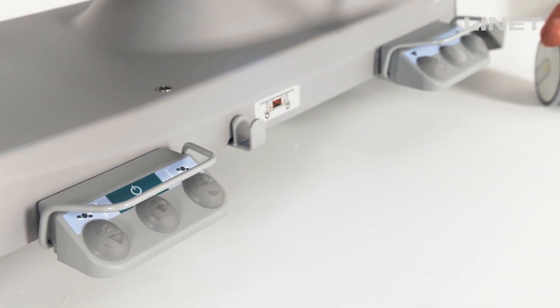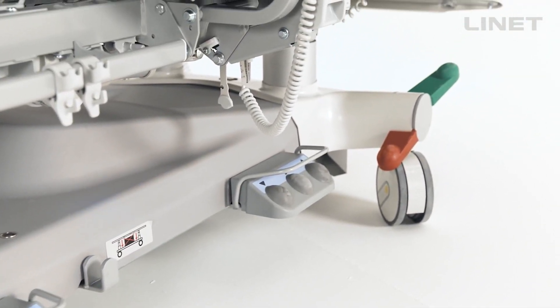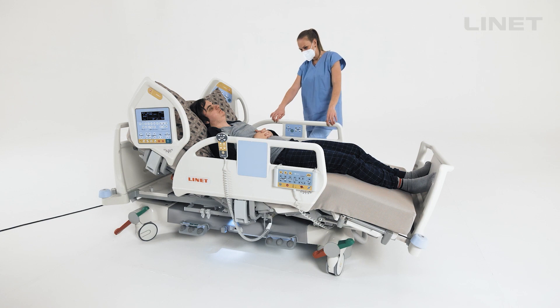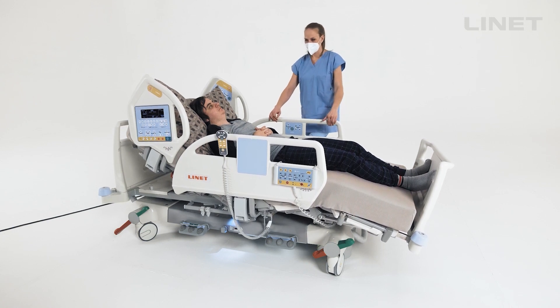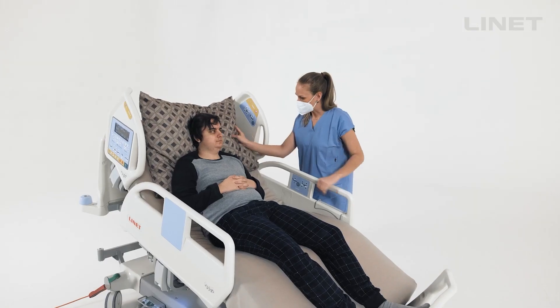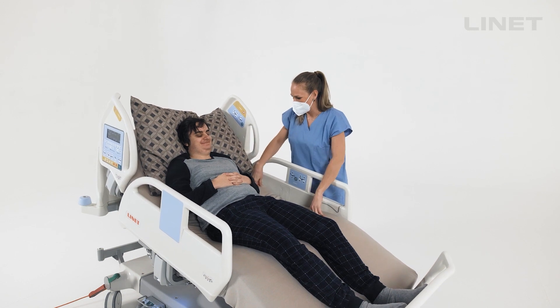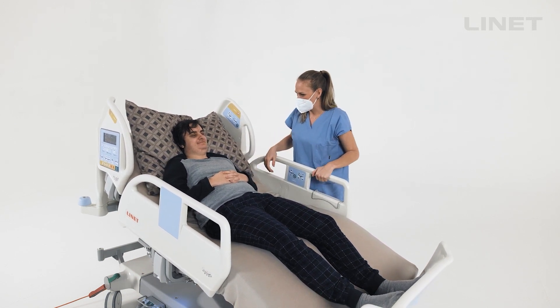Foot pedal controls are practical tools to operate the bed without hands. The nurse can have immediate contact with the patient and can see and react if anything happens. When the procedure is done in a sterile environment, there is no need to change gloves, because the bed position can be adapted by foot.